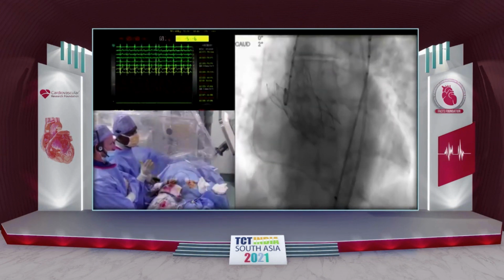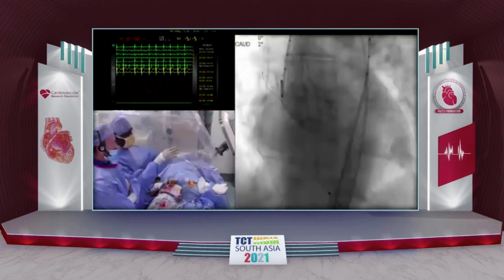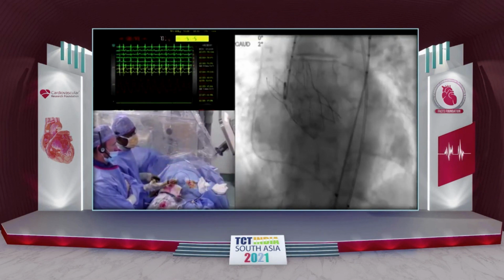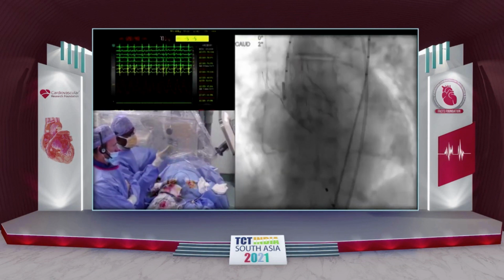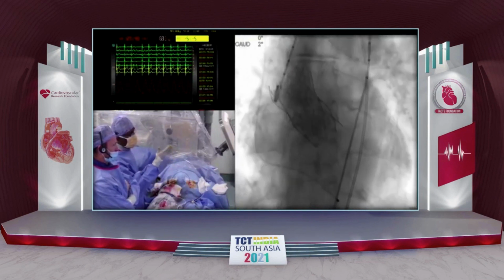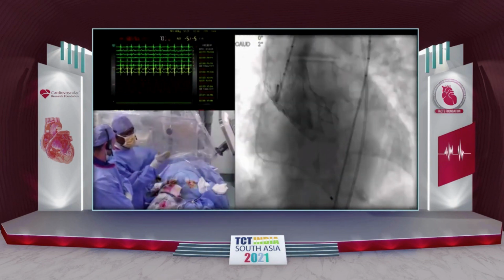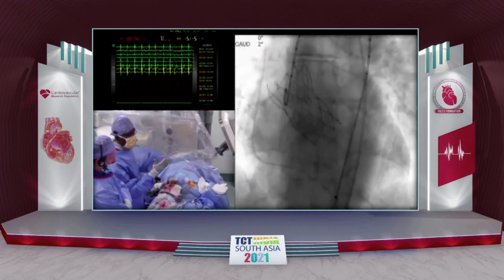Now, if somebody had truly horizontal anatomy, I think this or Sapien works very well. Now, Sapien, in this case, I think we would have almost definitely had a risk of annular rupture. If you don't have this in your technology, then using a double S curve Lundquist could help. But the other thing you can do, if you're using Medtronic Evolut R or Evolut Pro, is start high in the non-coronary and don't engage the annulus until the sleeve is just about to come up. Remember, the sleeve is about 1 centimeter away from the valve. Then engage the valve to the annulus at near 0, and then let it slowly expand up to 1/3.